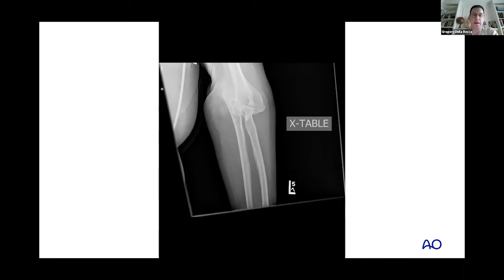So this is what we are looking at currently. The patient was brought in with an obvious elbow deformity, and he was brought to the emergency department with substantial amounts of pain. And this was the index image that we obtained. What you can see here is that it's fairly clear that the elbow is dislocated. There may be other things going on, but I would say that the first thing most people would notice is that the elbow is dislocated. You can see the distal humerus and the forearm do not have a normal relationship.